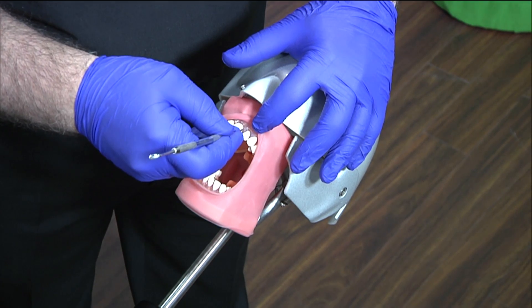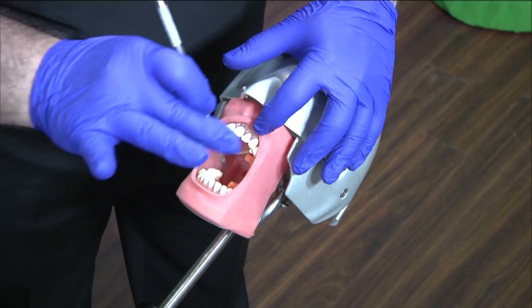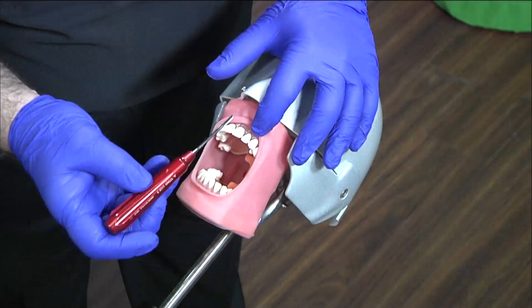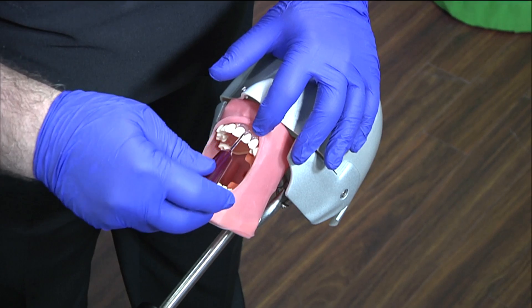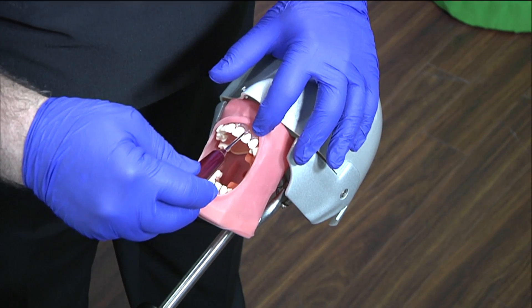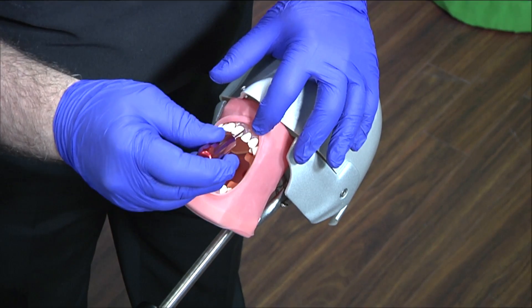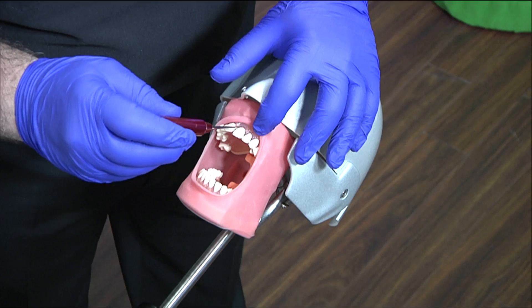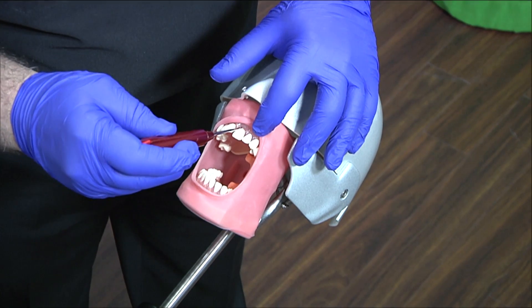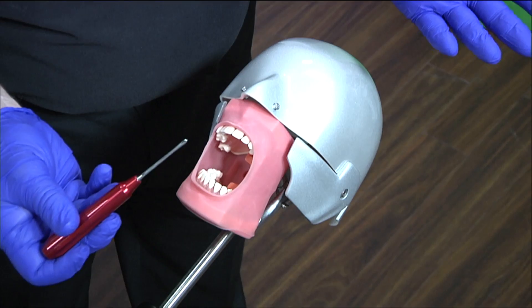At times you might rotate the instrument a couple degrees counterclockwise, a couple degrees clockwise, just to facilitate some movement. When you're done with that step circumferentially, then you have your choice of using one of the luxator-type instruments. This is a lux-3, and basically it's wider, and I'm applying apical pressure. I'm using my thumb and the pads of my index and middle finger rather than brute force with an elevator like we're taught to pry perpendicular. I'm circumferentially going around the tooth, avoiding the direct labial-buccal because the bone biotype is pretty thin there, applying apical pressure and ever so slightly some rotational twist, always remaining on the long axis.